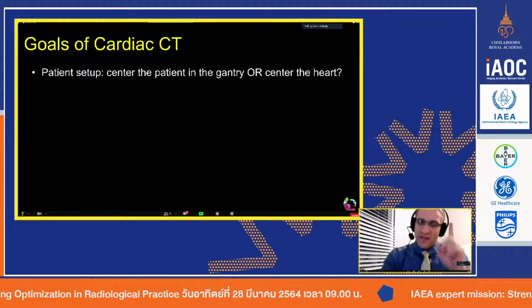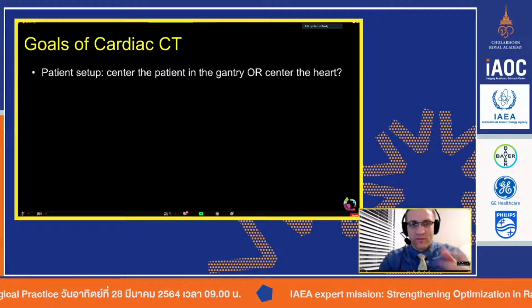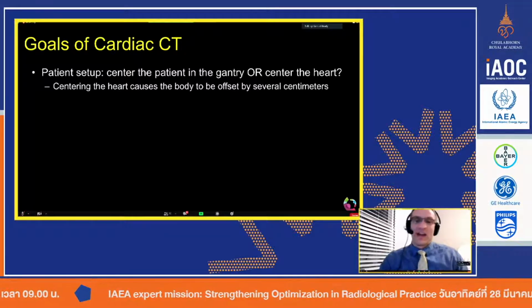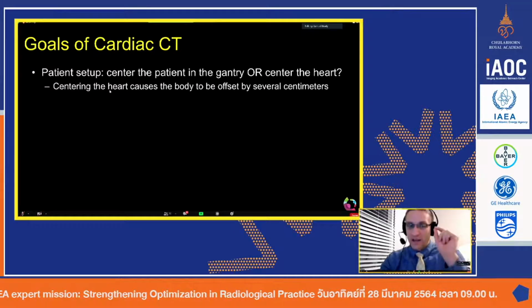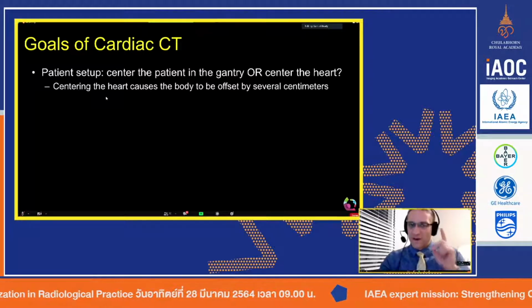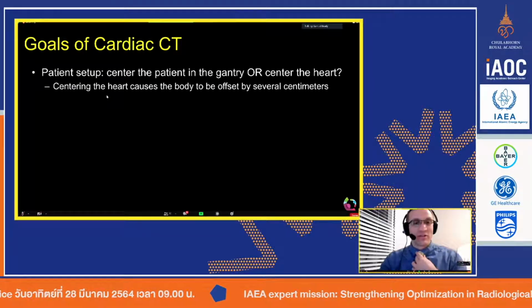And then one of your wonderful viewers said, tell me more about Hitachi. And so I did a lot of reading about Hitachi this week. And guess what? Hitachi actually has a very specific bow tie filter meant for cardiac imaging. This may have been the exact same person that asked these two questions. I'm not certain, but that's very astute. And this is something I didn't know. So I have to admit, I learned something new this week.